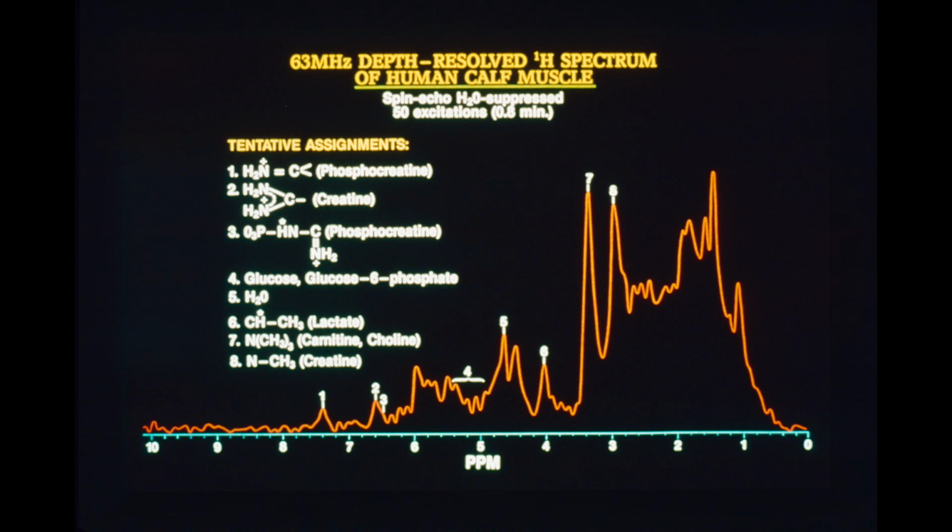So this shows one of the concerns that we have in terms of doing spectroscopy, is that large signals like fat and water, we have to get rid of those so we can begin to see other things within the spectrum.